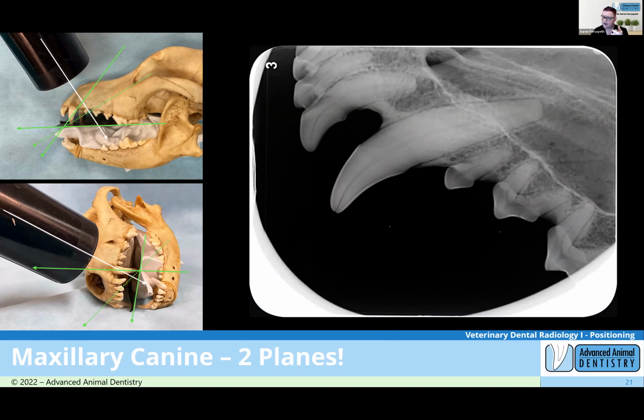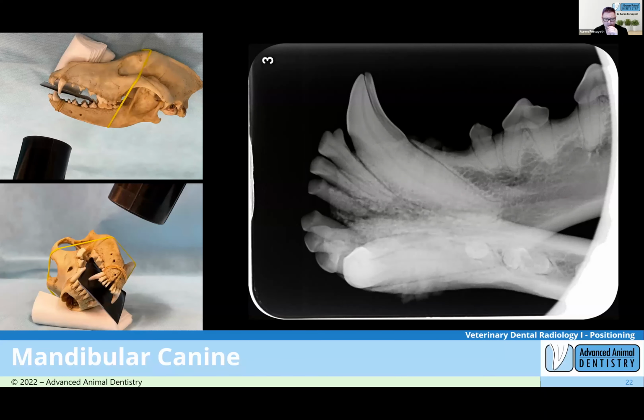Yeah. And I do it for the next shot that's going to come up as well. I pull the tongue through and put it through the canines and have it sitting there, and our plate does sit on top as well. That again stops it doing that rocking thing and takes that little bit of difficulty out of the horizontal plane for you.